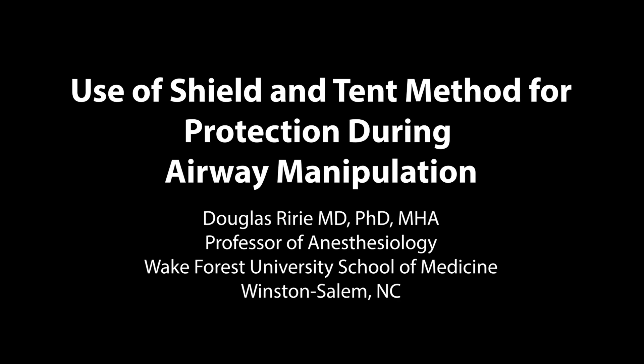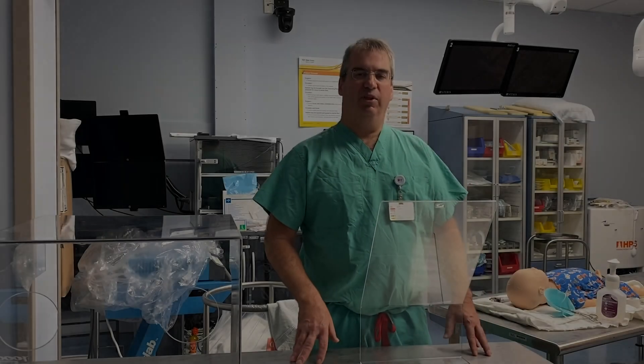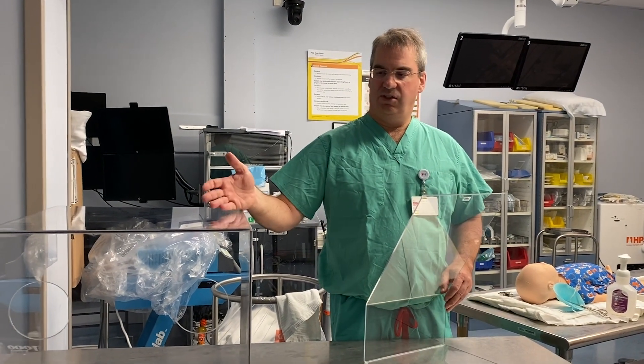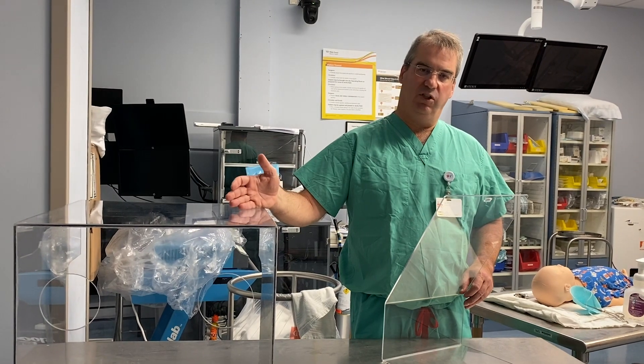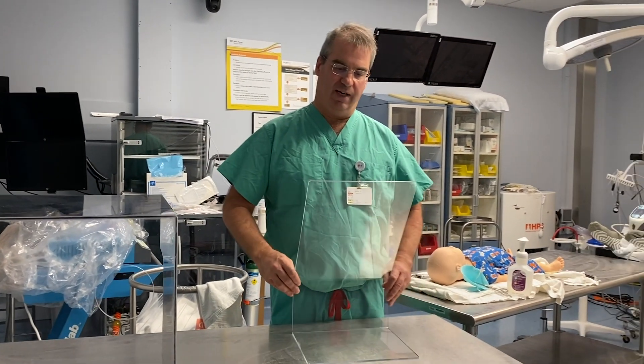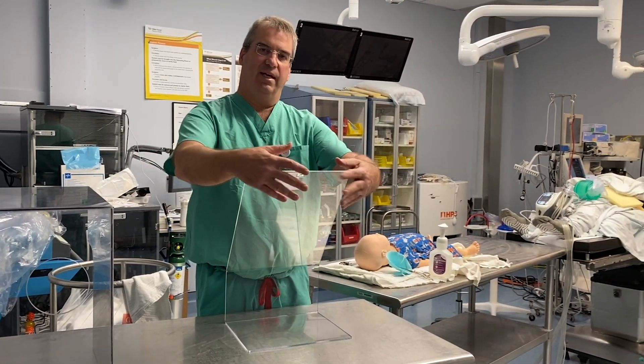My name is Douglas Ryrie from Winston-Salem, North Carolina. What I'm going to be showing you today is the shield with a tent. This is the shield and this is the standard intubation box which is being used many places. This is the shield that I'm going to show and demonstrate how we use it by making a tent.